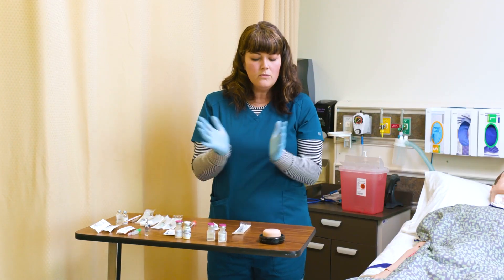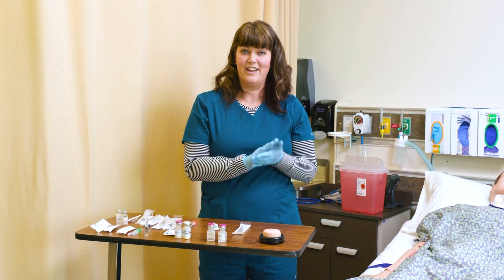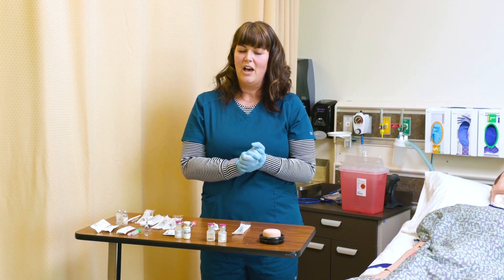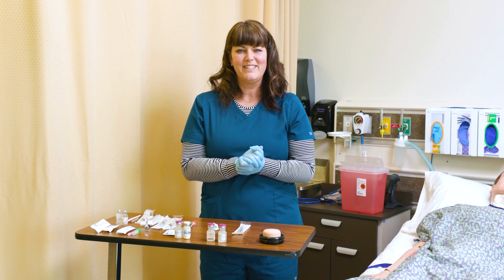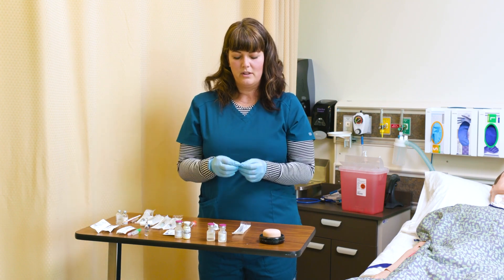Always, every single time you give an injection, the first thing you do is wash your hands. Wash your hands and put on gloves. People usually tend to have a little bit of blood when you give an injection, so always wear gloves.